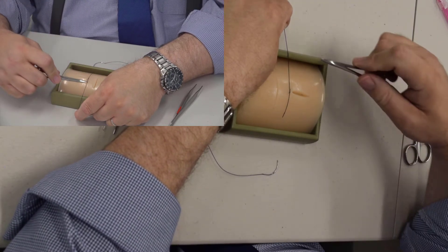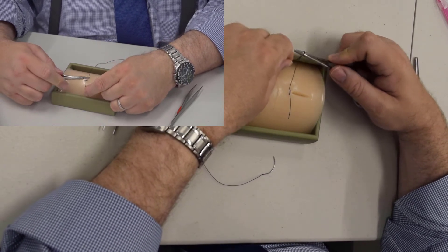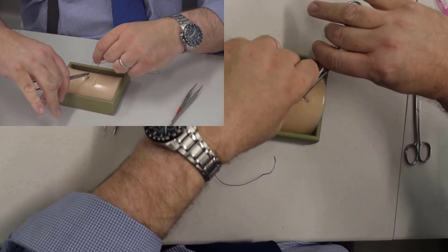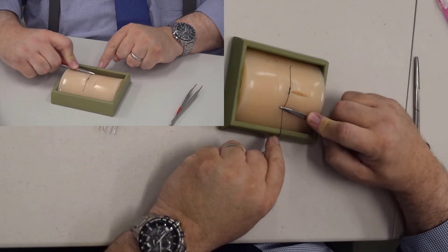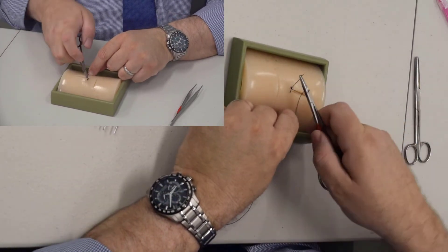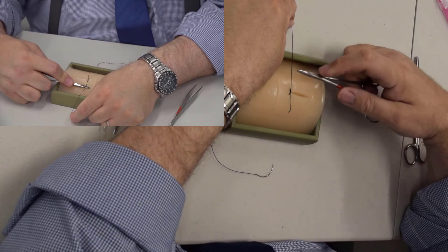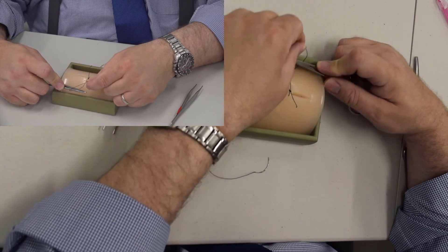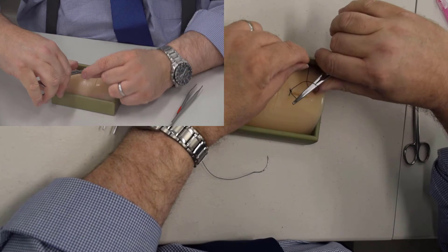Let go of the short end. Needle driver goes on top of the stitch again, but this time it's only one turn around the needle driver. Cross your hands again. Needle holder goes on top of the suture, one wrap, grab the short end, cross your hands. Lay the suture flat, needle driver goes on top, one wrap, then cross your hands again.